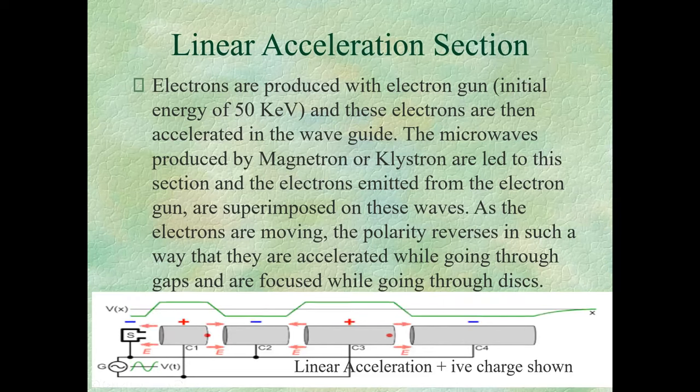And maximum energy is equal to the energy of the incident electrons. So whatever the incident electron energy was, that will be the maximum energy of the X-rays. And as a rule of thumb, the average energy of this X-ray beam is 1/3 of the max electron energy. Electron beam is designated MeV because it is almost mono-energetic. So this is common when we say we have 6 MeV electrons or 9 MeV electrons. We call it MeV. And when we are talking about X-rays, we say MV, megavolts.